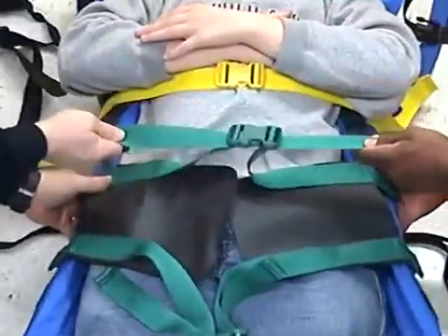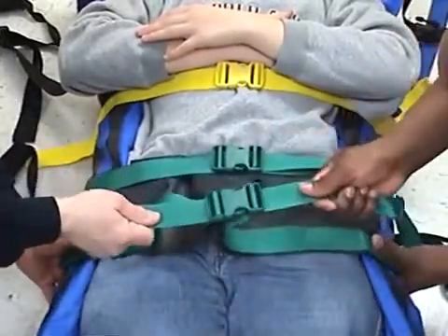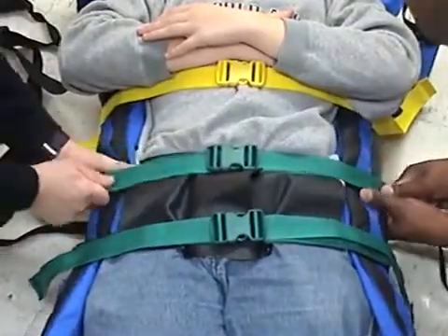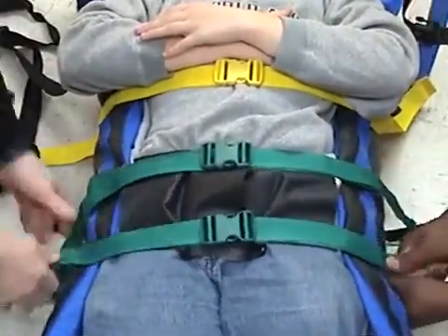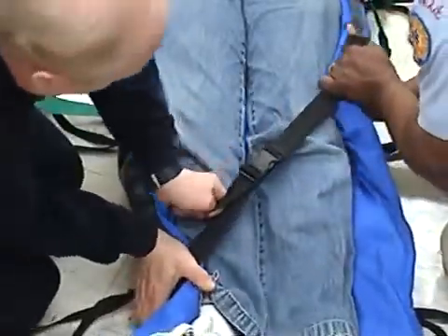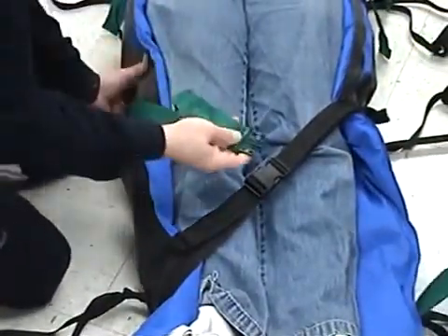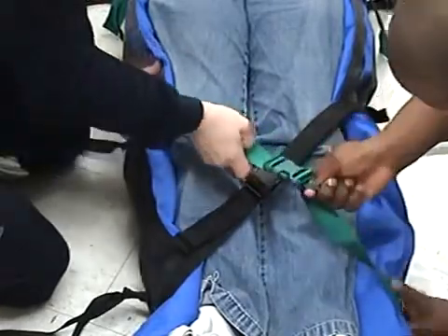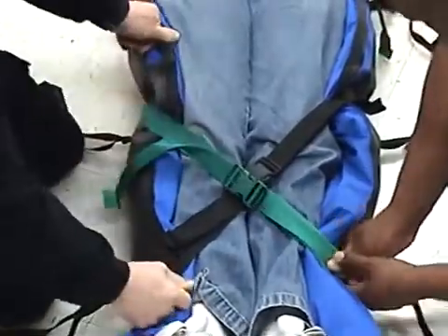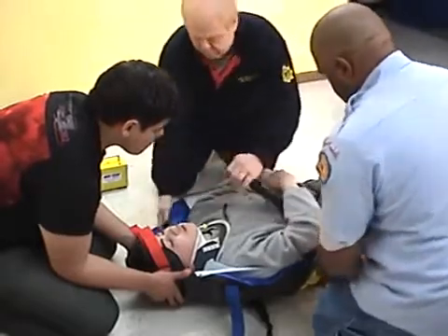Close that in this position. With possible open book pelvic fractures with suspected internal bleeding, use firm strength. Then buckle the black and green cross leg straps, and finally the black and blue cross chest straps.